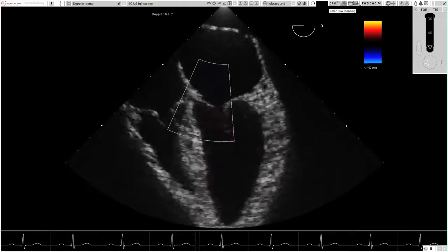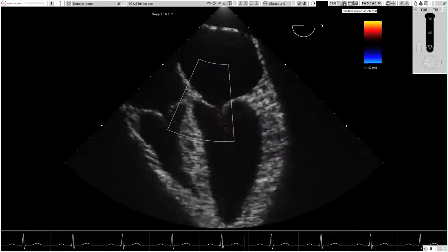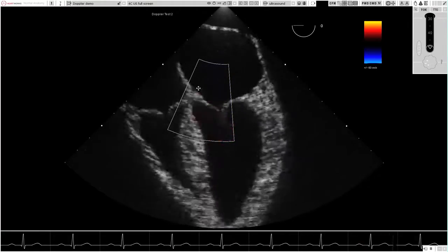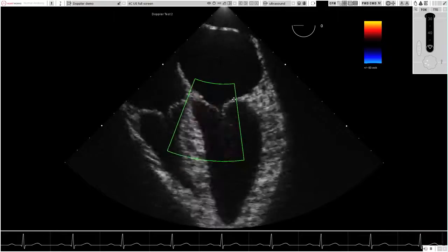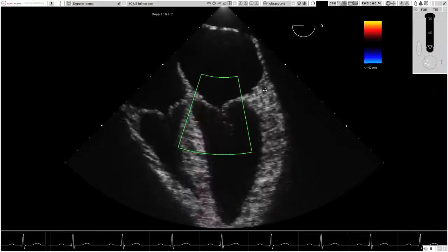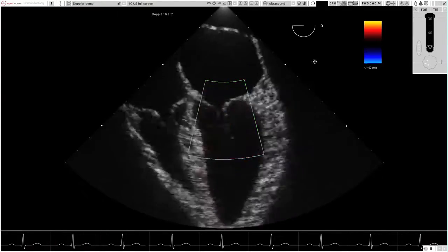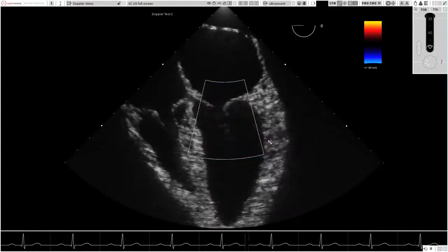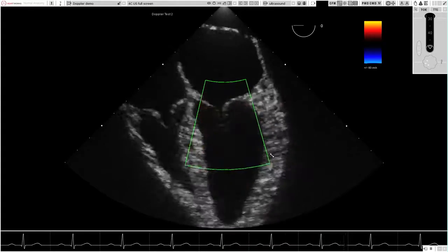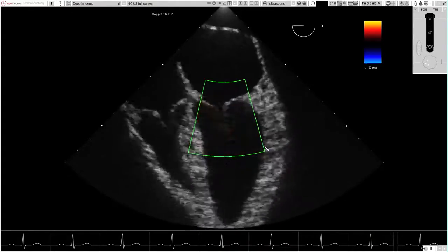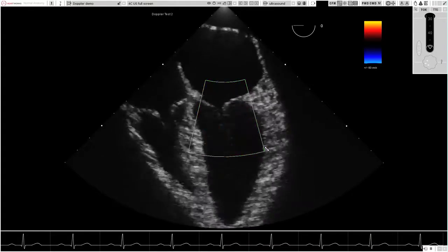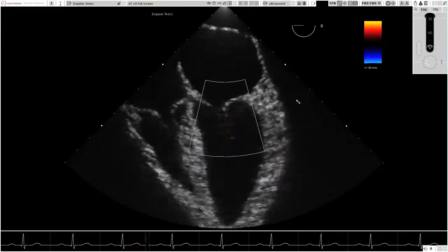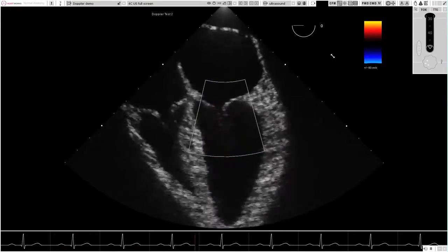Color flow mapping allows the user to both position and resize the region of interest, in addition to manipulating the velocity scale. These features encourage an understanding of the appropriate use of color flow mapping settings by students, as well as demonstrating normal color Doppler appearances of blood flow through the entire heart.